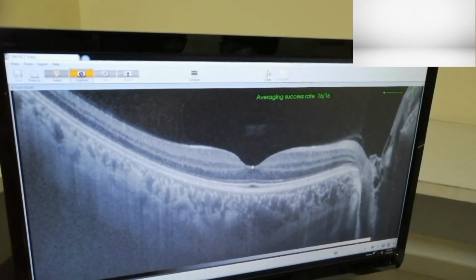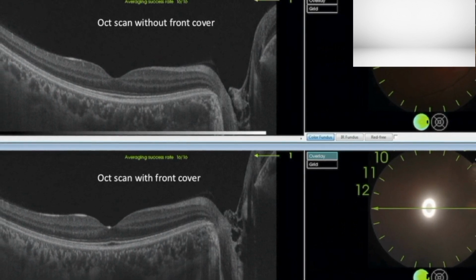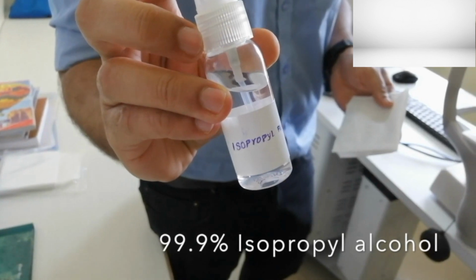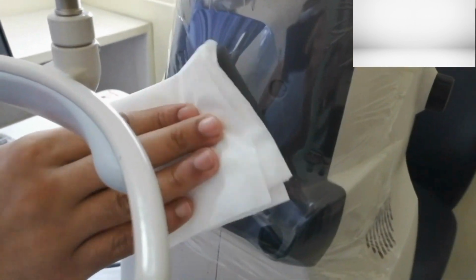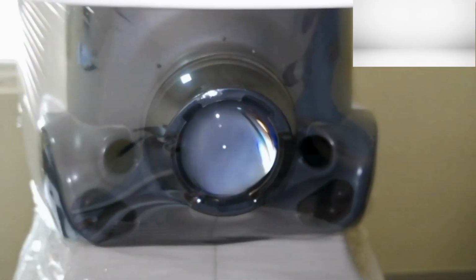As you can see, the scan quality is not affected. This picture shows a comparison of image quality obtained in an undilated patient without and with the front cover. For cleaning, isopropyl alcohol can be used. Take a clean tissue paper, spray isopropyl alcohol on it and clean all around, especially the area covering the lens and the sensors. We can see that the cover is absolutely clear with no contamination or fogging.